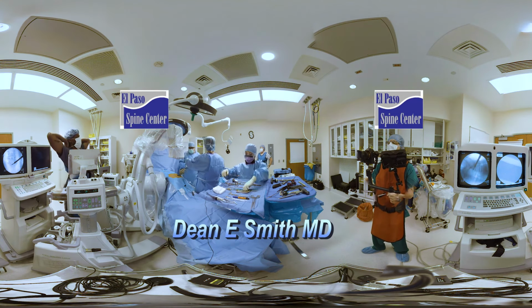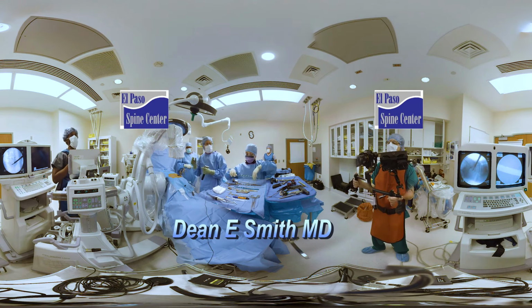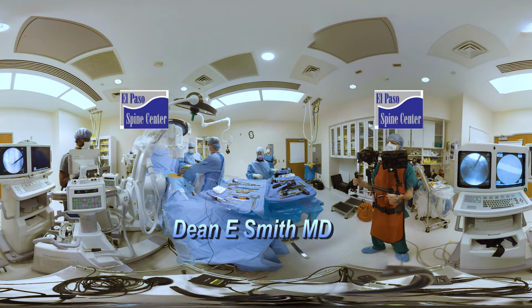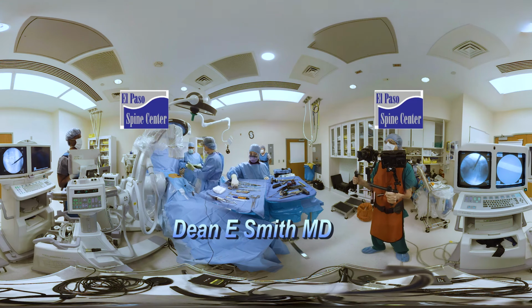And this is actually how we push in the mixture of stem cells and bank bone. It's really viscous and thick, so we have to kind of tap on it. This is what scares everybody when they watch the video. But actually, as I do this, his pain is going away.